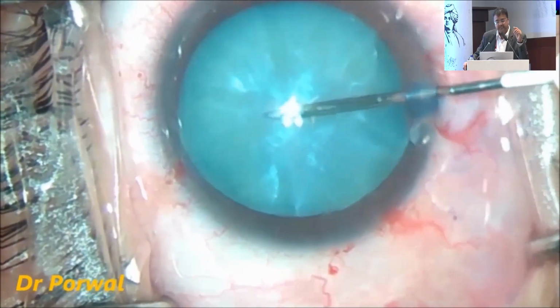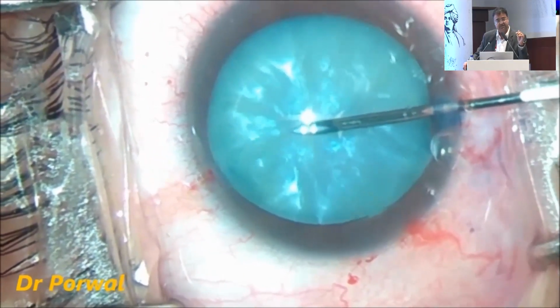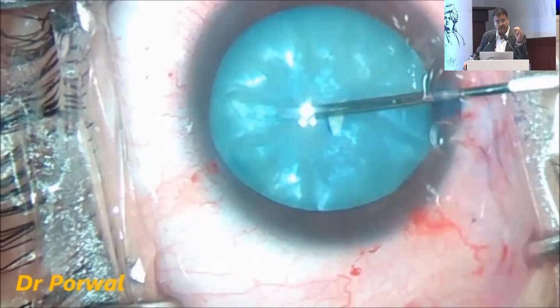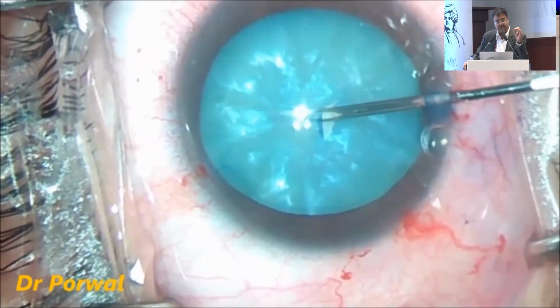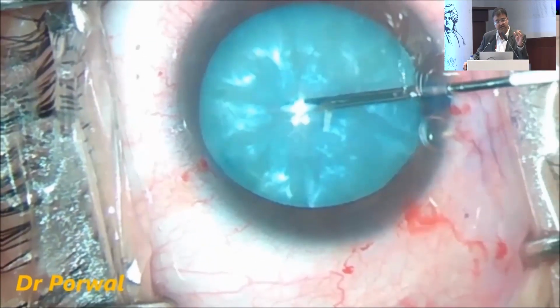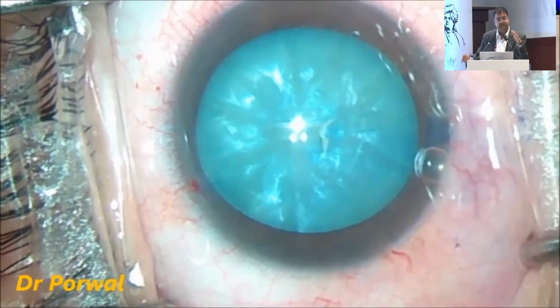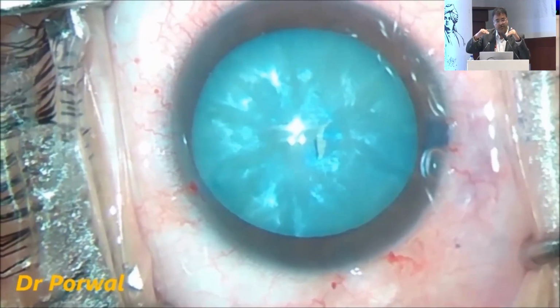Now you see, I am piercing the center of the anterior capsule with a 24 gauge needle, which is mounted on a 2cc syringe. You have to be gentle, steady. Only the bevel of the needle should be pierced inside. You should not have any tremors, and you try to aspirate. The moment I aspirated, you saw the bulge, the convex became concave.